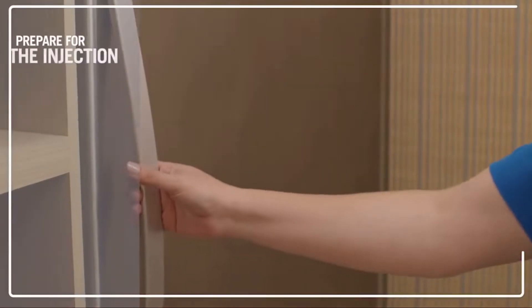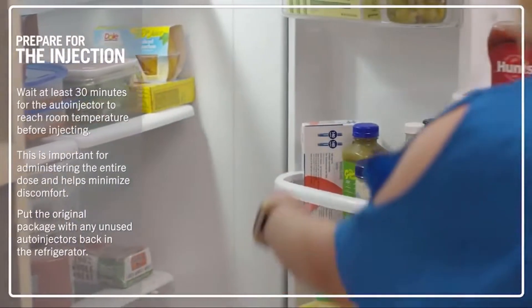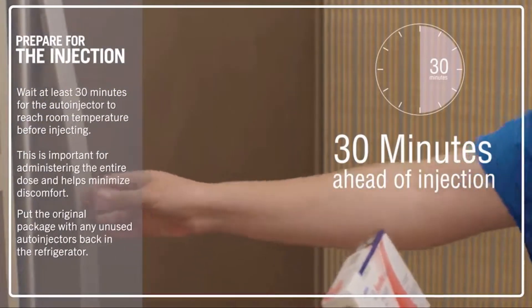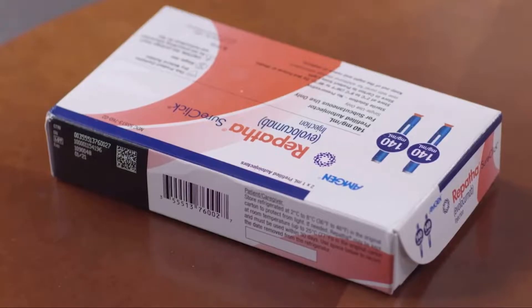When you receive your Repatha, you should put it in the refrigerator right away. When you're ready for your injection, you need to remove your Repatha SureClick auto-injector for at least 30 minutes. This is important for administering the entire dose and helps minimize discomfort. Some people like to use the timer on their phone, but you can actually leave it out for up to 30 days. I like to take mine out of the refrigerator the night before so that it's ready and waiting for me first thing in the morning. It's important to let it come to room temperature naturally. Don't rub it or put it in the microwave or under running water.